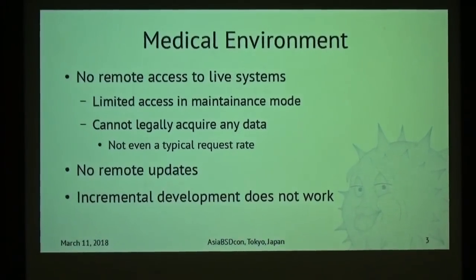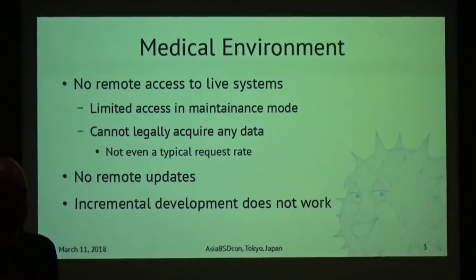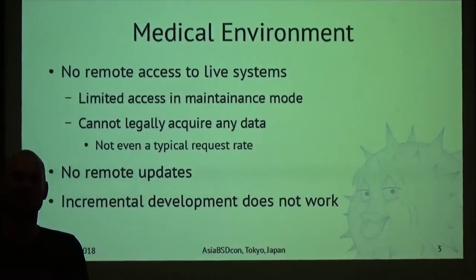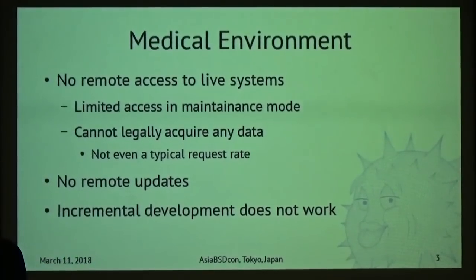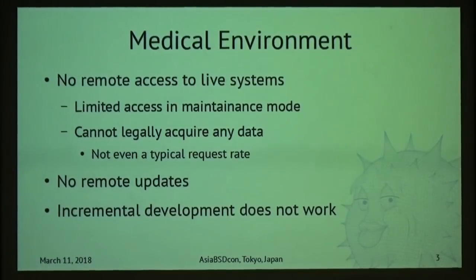It is outright impossible to get remote access to these systems. There actually is a little bit of remote access, but when that remote access is active, the machine is rendered unusable and the operator screen goes all red and it's not operable anymore.